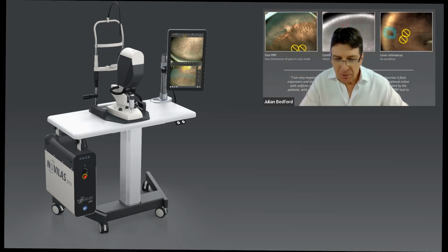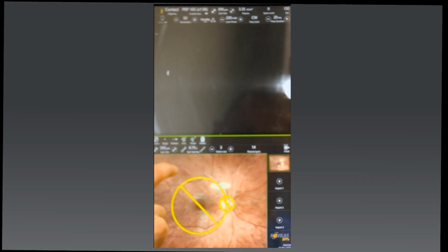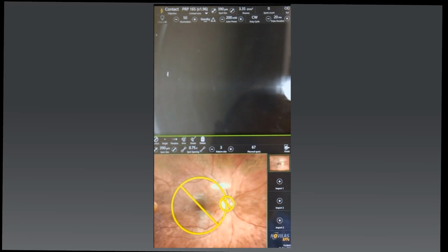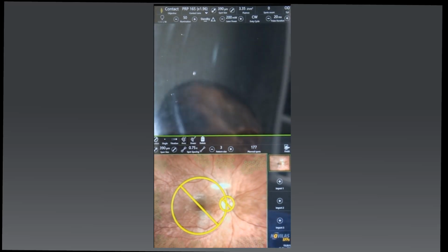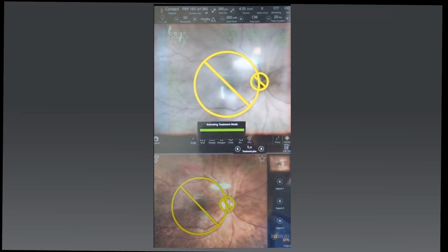And now, as we have some treatments and case examples you prepared for us, would you mind talking us through those, please? Yeah. So basically, this is a patient, this is his first treatment in this eye. I've just taken the initial shot of the posterior pole, and then this is where I do a little bit of titration. I've just mapped a few areas around the macula for those initial shots to get the initial power, and just check patient tolerance, really.